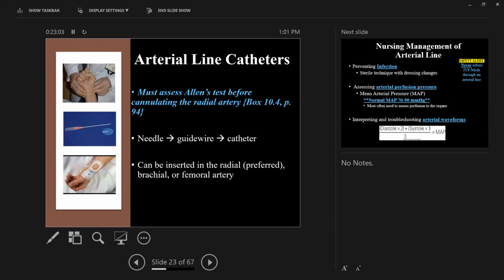Now, a couple things I want to tell you. Students will always say, I didn't feel the pulse there. You are not going to hurt the patient by trying to palpate the pulse, but certainly don't hold your fingers there for 20 minutes and really occlude it. You certainly need to check circulation of this hand. If this becomes occluded and I lose circulation here, you're going to see this hand become cold.